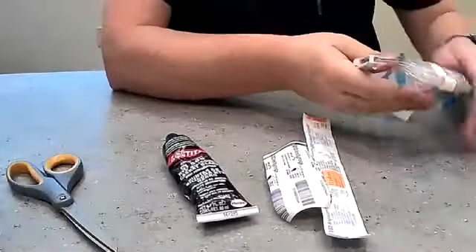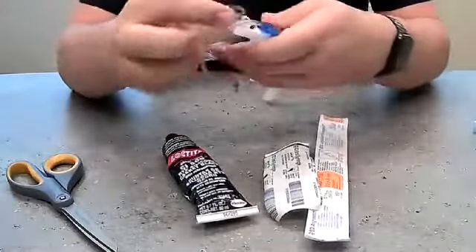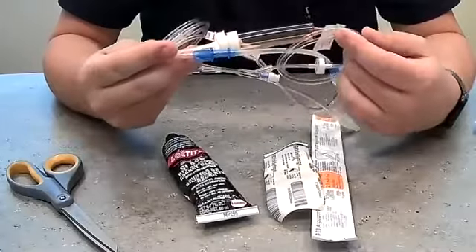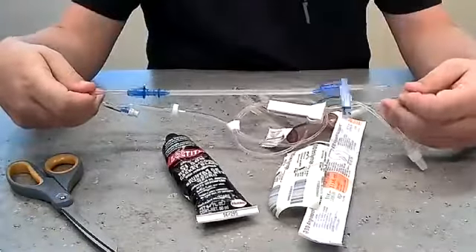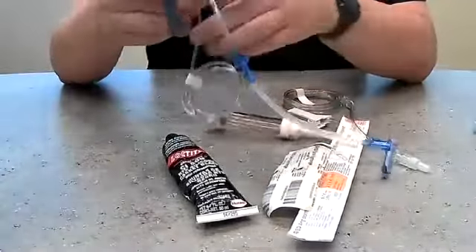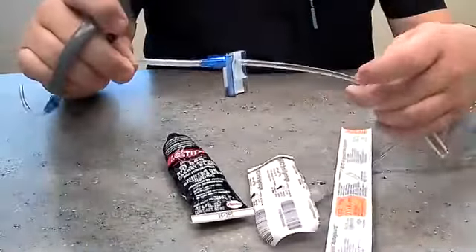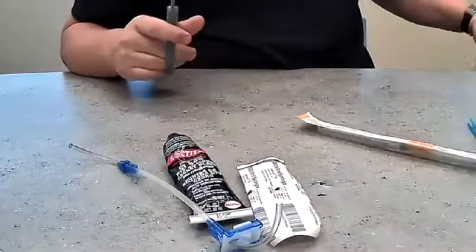First, we'll take the infusion set here and pull off what we don't need. You don't have to use new sets — this is obviously a brand new set for demonstration purposes. Every once in a while we pull some of our old bags down, replace the sets, and set those aside. The only thing we need is the part that's going to fit into the Alaris pump. Cut above the top part of it by about two to three inches, then throw that away. Go down to the bottom and give that about the same two to three inches, then throw that away or use it for something else.